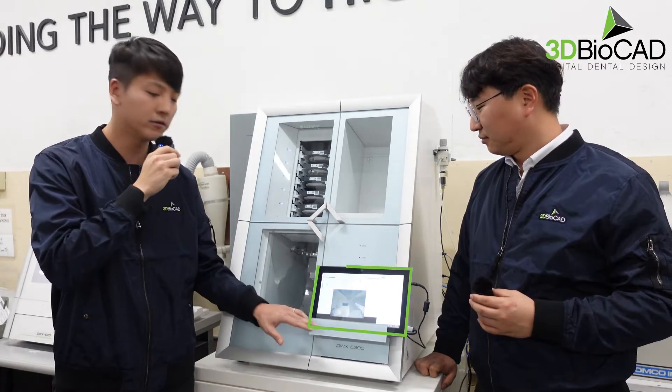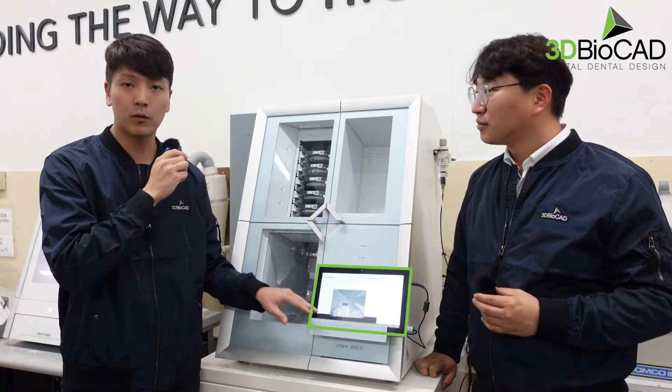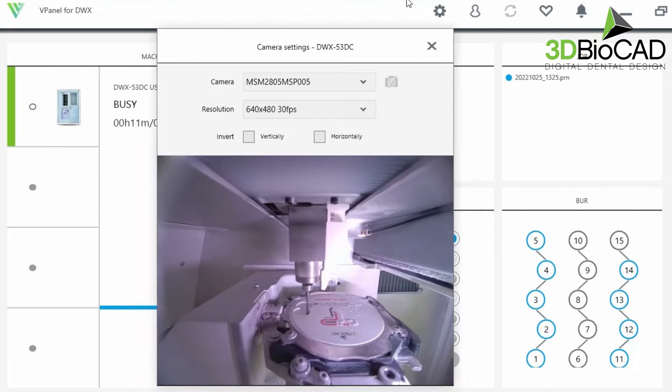One key difference from the 52D is the internal camera in the machine. So even after you've left the workplace, you can check every single detail by automatically connecting the camera with the internet.